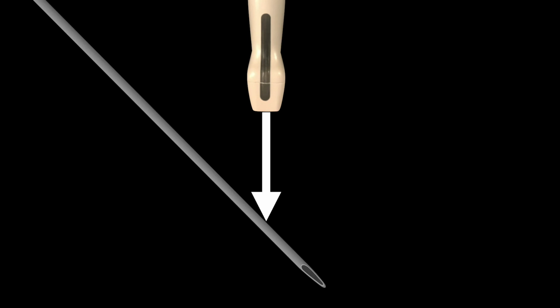So the ideal is typically about 45 degrees that you're going to go down. That way you don't lose a bunch of signal. You can see your catheter or your needle quite well, and you can also kind of calculate the length you're going to go. So then we can talk about depth. Now depth, the more superficial you can go, the better, but typically, getting down past a couple centimeters gets more difficult, and I would try to pick the most superficial one you can.